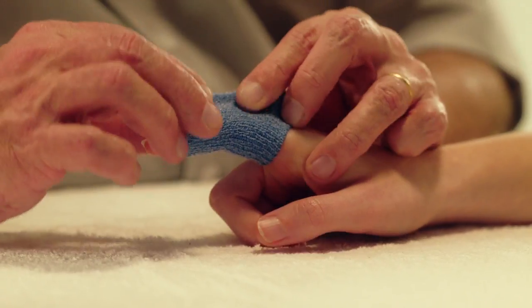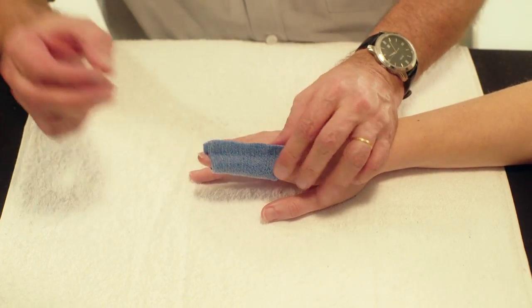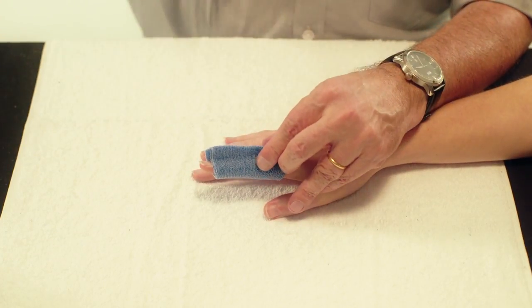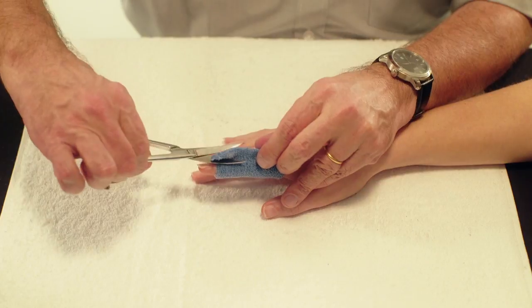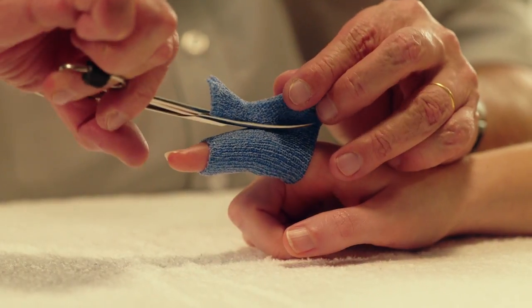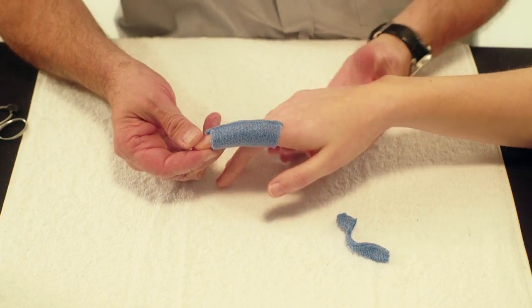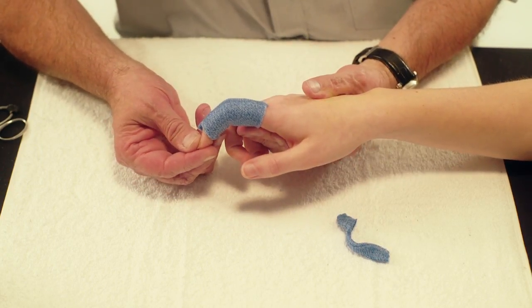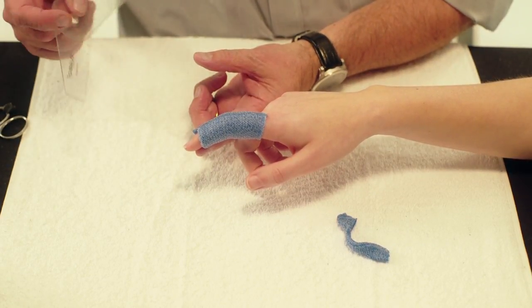Make sure to cover the entire length of the proximal and middle phalanges to the DIP joint of the finger. Cut away any excess material. Maintain the finger in 30 degrees flexion. This can be controlled with a small finger goniometer.